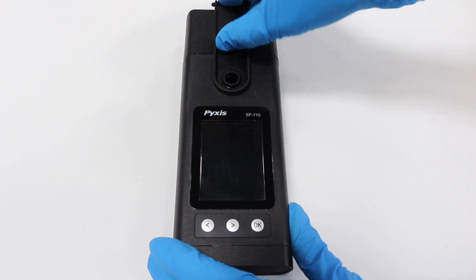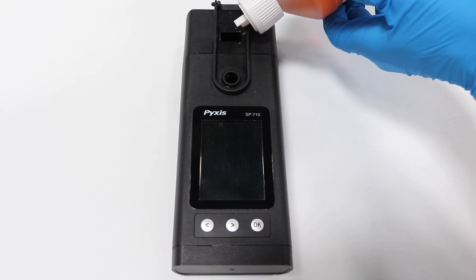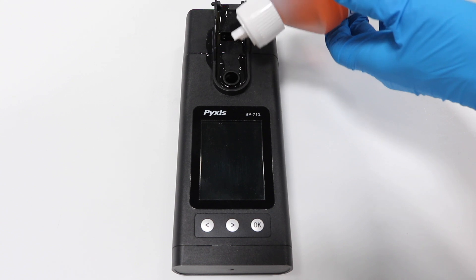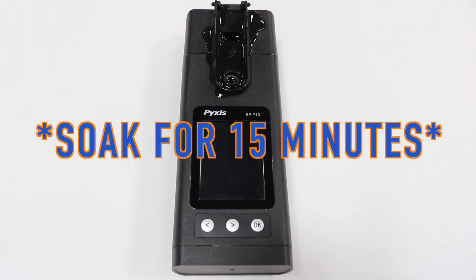Begin by opening the shield and pouring handheld cleaning solution into the PHORP module and the main sample well. Let the solution soak for 15 minutes.